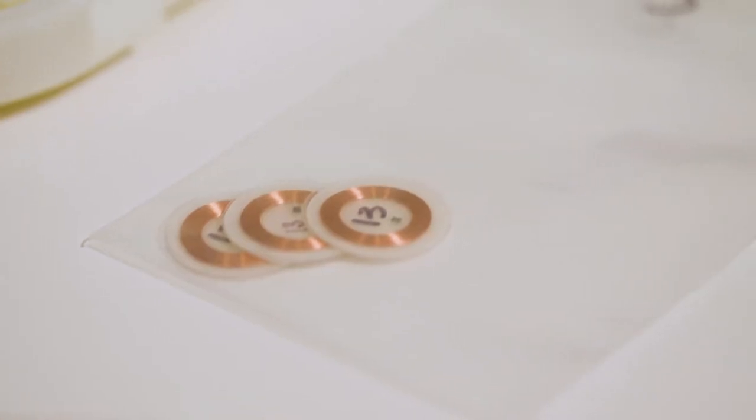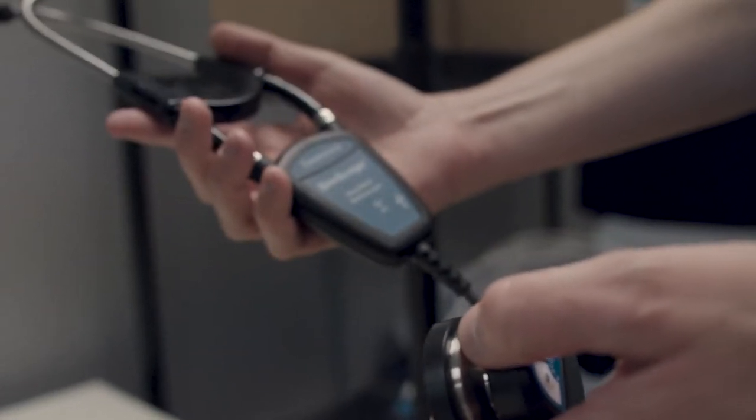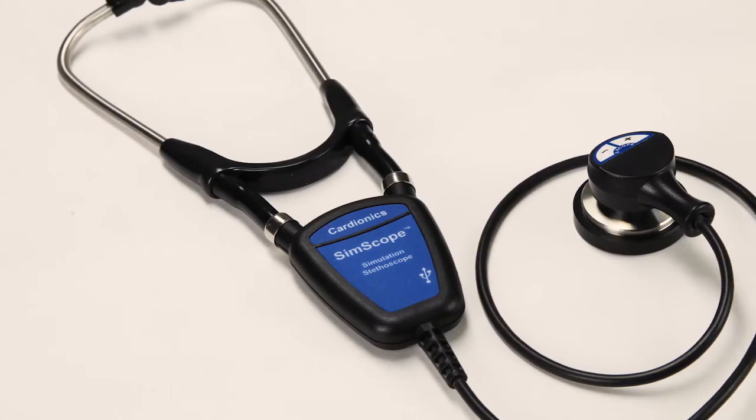The simulation suit has three primary technologies. The one that's most significant, of course, is the RFID tag — the technology that Cardionics has developed that works with their SIM scope.